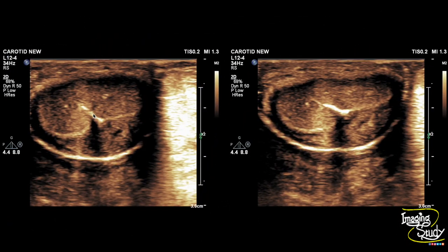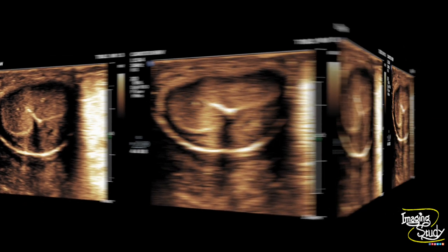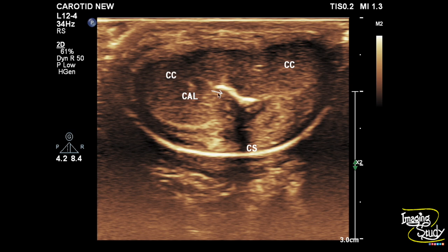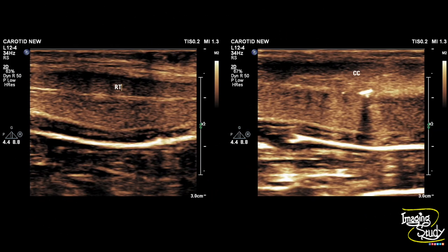Here is another picture showing the calcified plaques within the tunica albuginea between the two corpora cavernosa. Another picture with markings — you can see these calcified plaques casting faint posterior acoustic shadows. This is the longitudinal section showing a normal corpora cavernosa and the cavernosal artery.